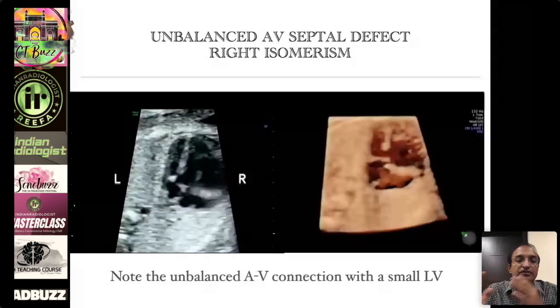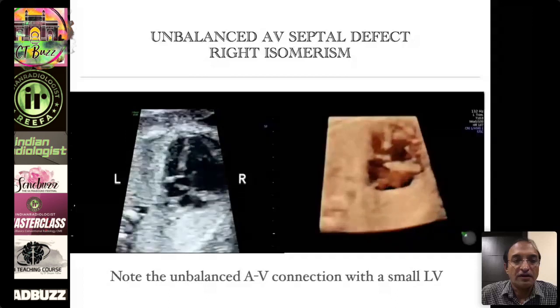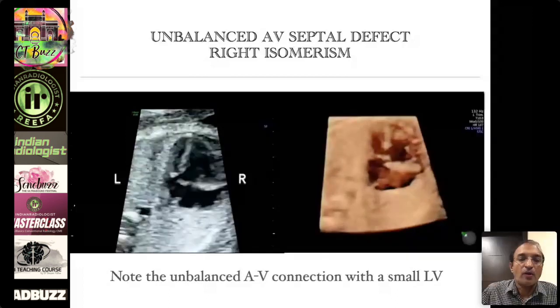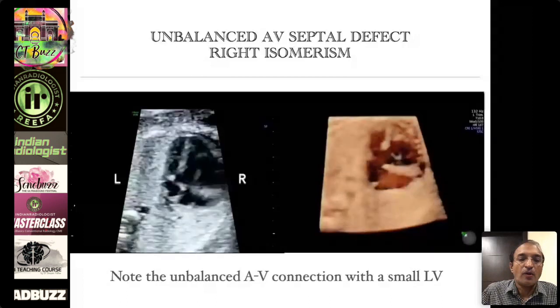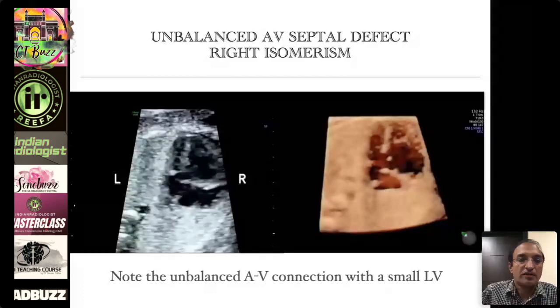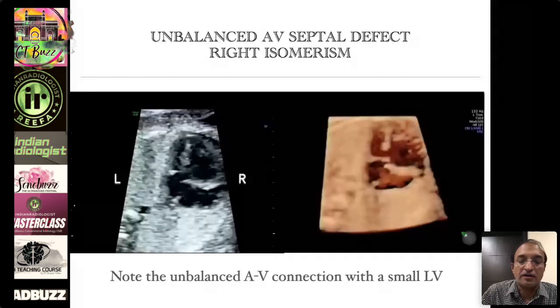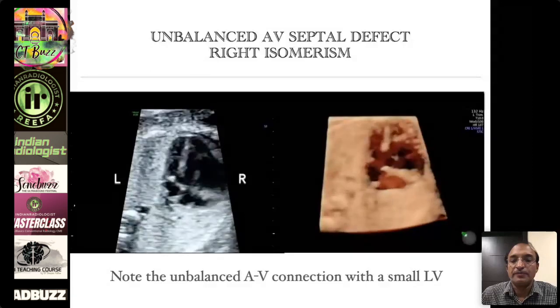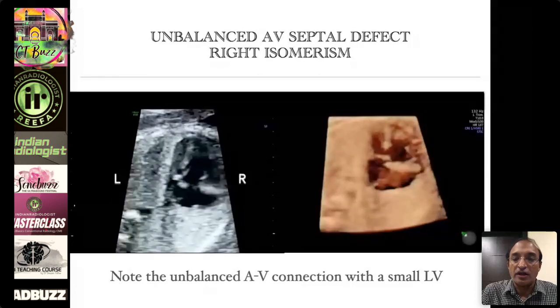This is not left heart hypoplasia. You are seeing a small LV, but that is not a correct diagnosis, so please do not label this condition as hypoplastic left heart syndrome. I have seen several reports where unbalanced AV septal defect is incorrectly reported as hypoplastic left heart syndrome. The correct terminology is unbalanced type of AV septal defect with small LV. This is often part of an entity called right isomerism.